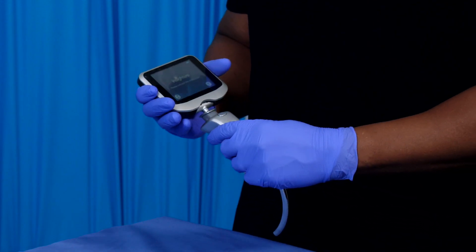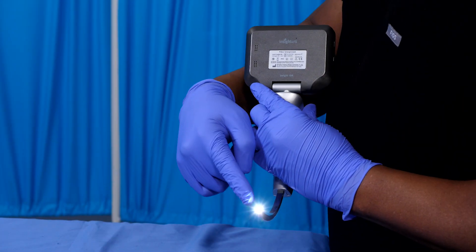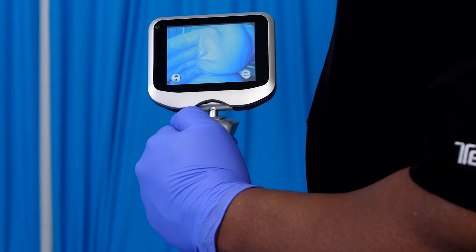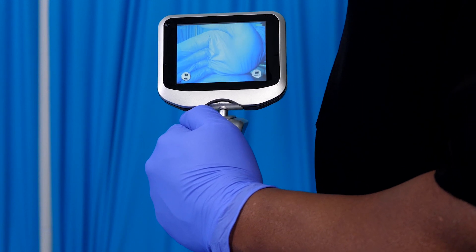Connect the handle to the screen. The light on the distal end of the handle will light up, and the real-time anti-fog system will automatically start. At this point, you'll want to confirm the image from the camera is displaying normally and clearly on the screen.